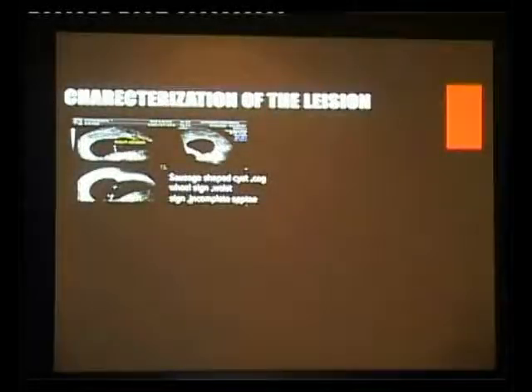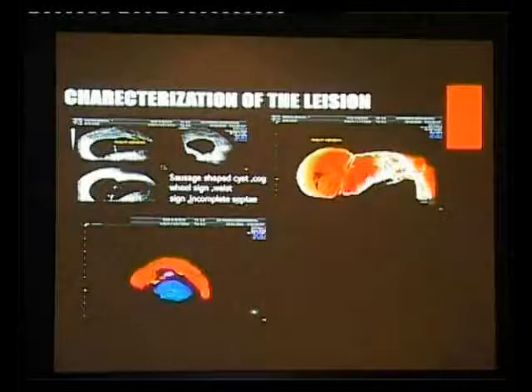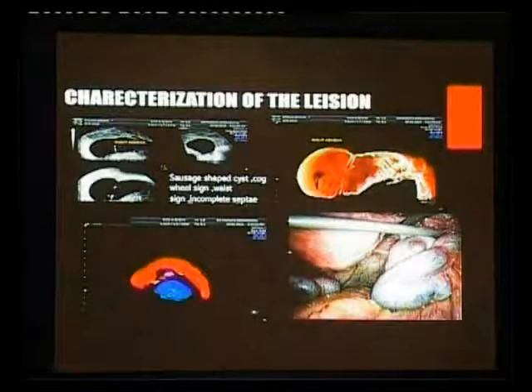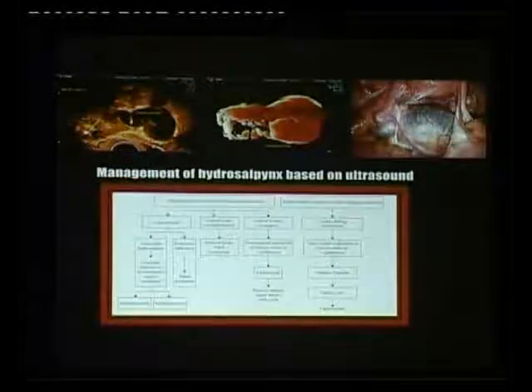So we started to characterize it, and of course, like the previous speaker spoke, all men seem to be obsessed with women, so they call it the woman's waist sign. I don't know whether it's W-A-I-S-T or W-A-S-T, because it doesn't make a difference when you have a sono AVC. We then reconstructed these images, and they're so beautiful because you can tell the patient beforehand that she's got a bad tube, she's got synechiae within the tube. That's what we saw, and we did a salpingectomy.